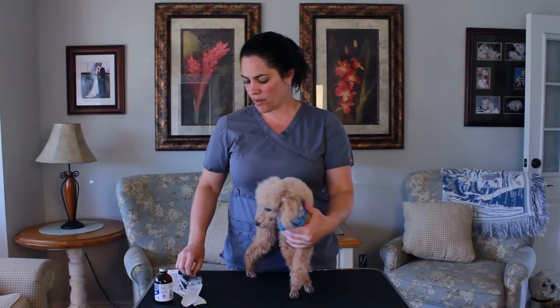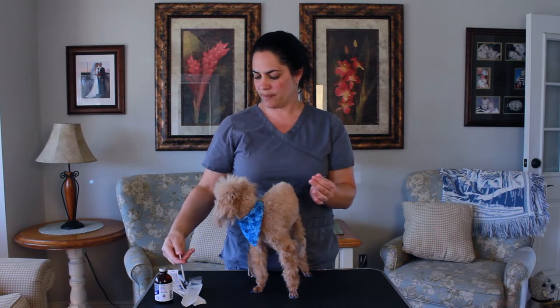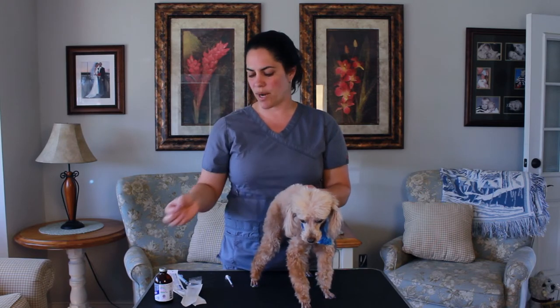When you're done, the body of the syringe can actually be thrown away — that can go in the trash, and that's totally legal. The part that's not legal is the needle. The needle should go into a coffee can, and the next time you see your vet they can dispose of it for you properly. Good luck.